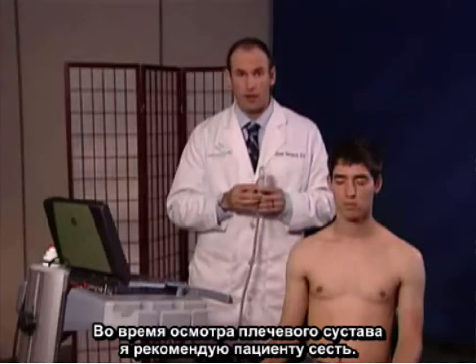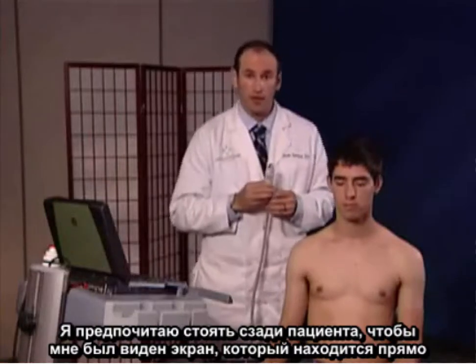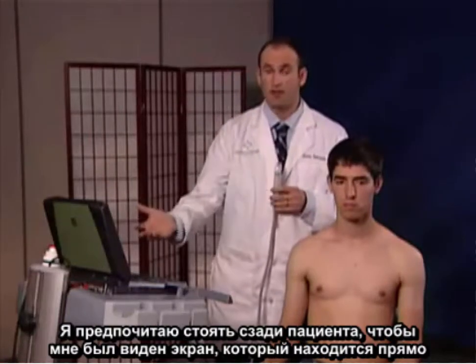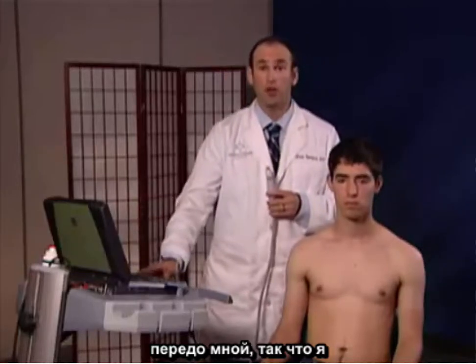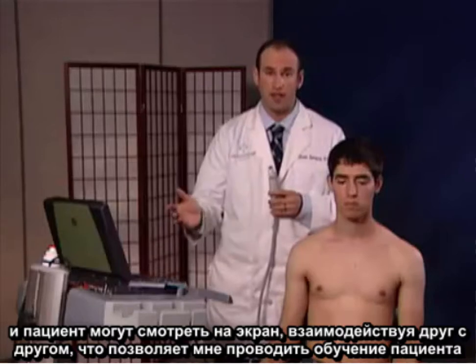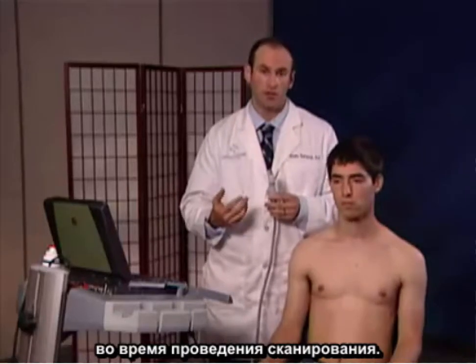In looking at the shoulder, I recommend that the patient is in the seated position. I prefer to stand behind the patient so that I can look at the screen, which is in front of me at approximately a two o'clock window, so that both the patient and myself can look at the screen and interact and educate the patient while I'm doing the scan.